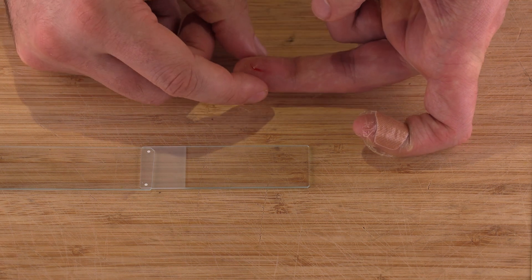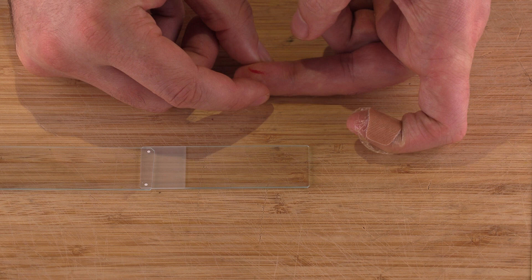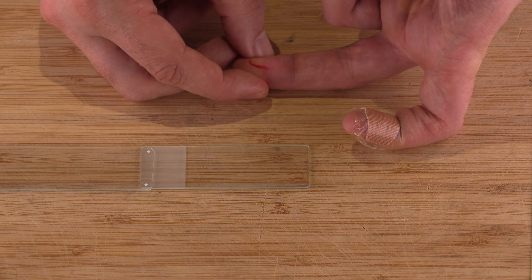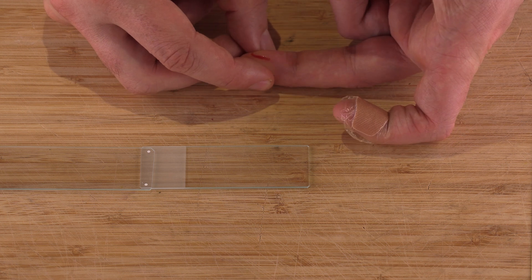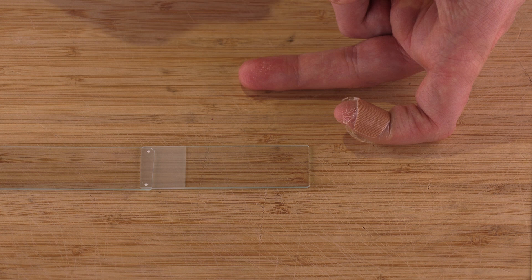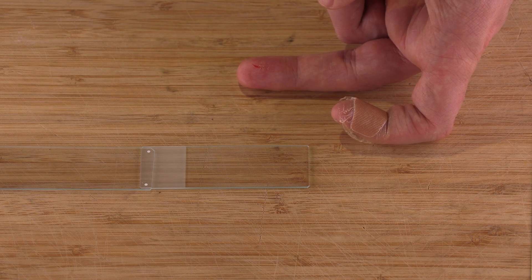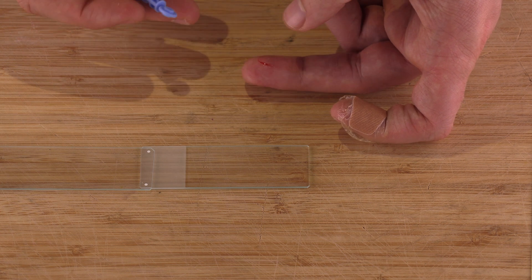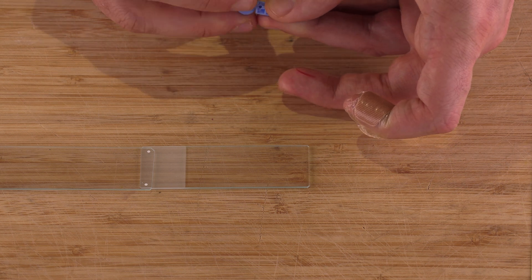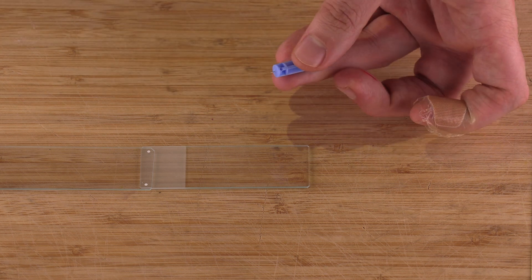Now I'm squeezing where I have that little pin prick and I'm trying to get enough blood out and I want it to be in kind of a little bubble like a little drop but it's not really working. I don't know if it's something with my skin or my blood coagulates too quick but that little purple thing doesn't work really well for me.